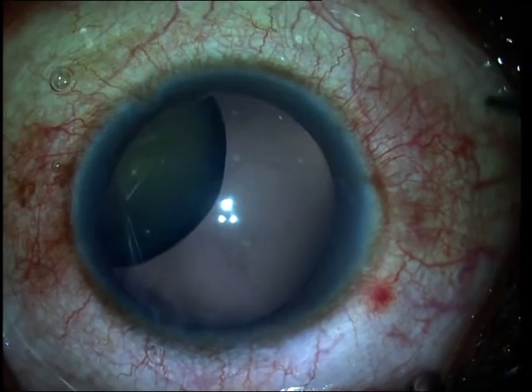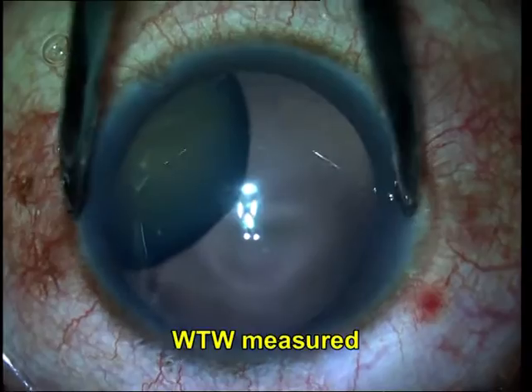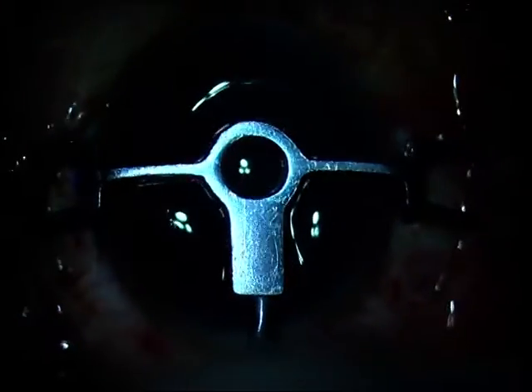We decided to go ahead and remove the subluxated lens and fix a glued intraocular lens. So what I am doing first is measuring the white-to-white diameter to make sure that I would have enough haptic exteriorized to get me a stable intraocular lens.